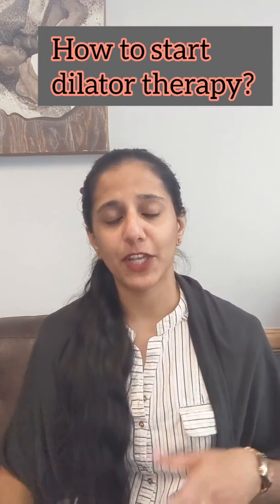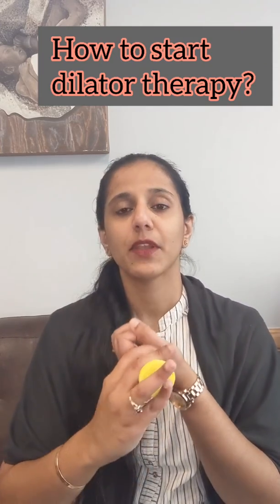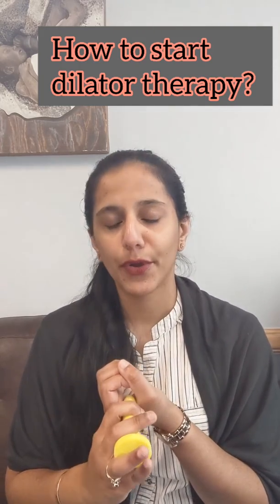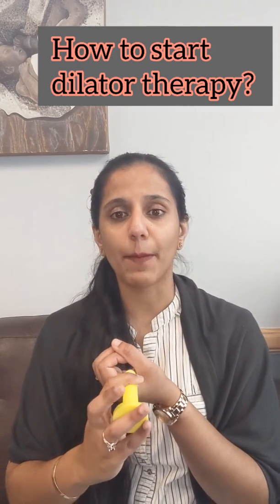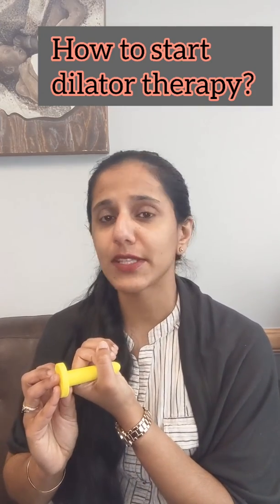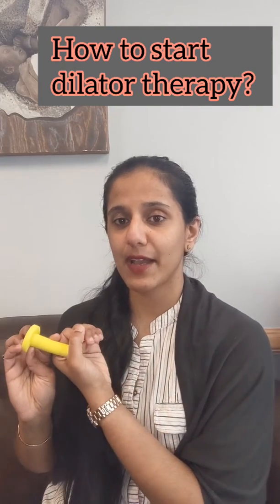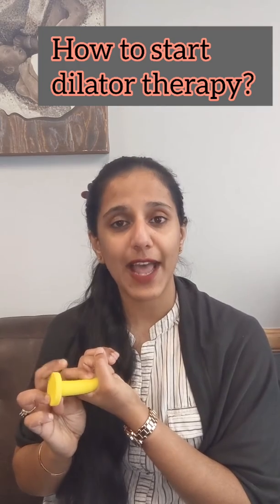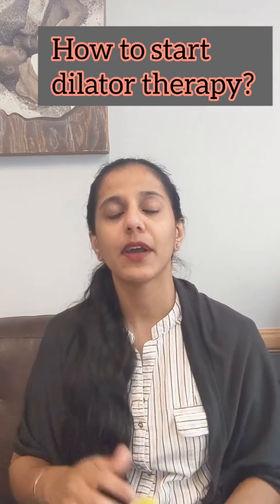So put your guided meditation on, do some nice deep relaxing breaths and just stay at the opening. Put some pressure downwards and breathe through it. Do that for 15 seconds. Ease up. Now gently, if you can, slide inwards just a tiny bit. Again, if it hurts, we won't do it. We'll slide back a little. So you'll slide back a little, stay there and breathe and relax and visualize that muscle opening up and relaxing.